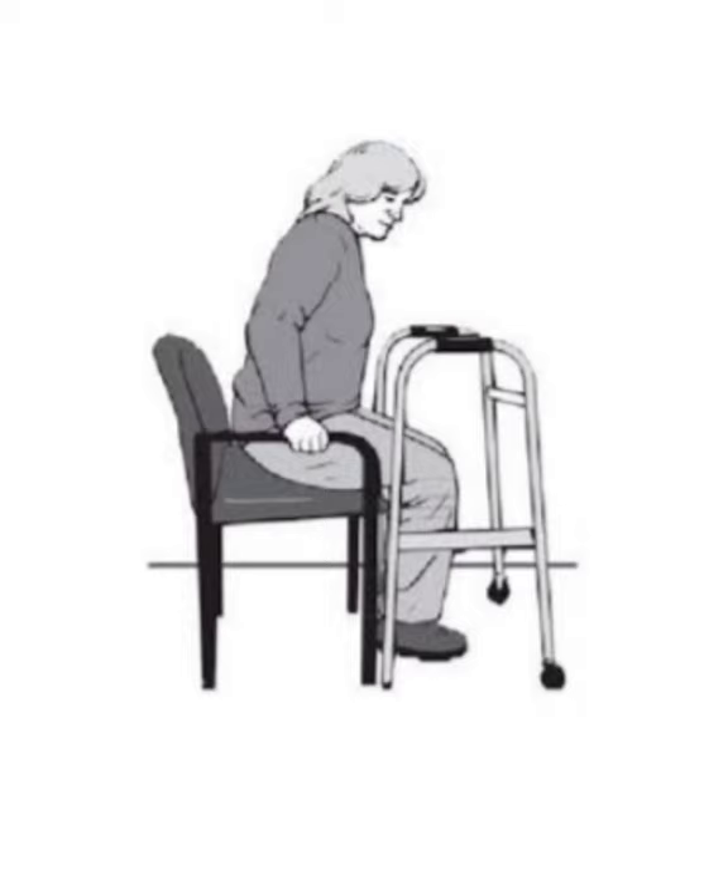While standing, place the walker in front of you, but avoid grabbing the walker to try and lift yourself — this will cause the walker to tip and you will fall backwards. Instead, use your hands on the armrest or seat to help press up to stand. Once you are mostly upright and steady on your feet, grab the walker one hand at a time. Stand for a few moments to make sure you have your bearings before beginning to walk.